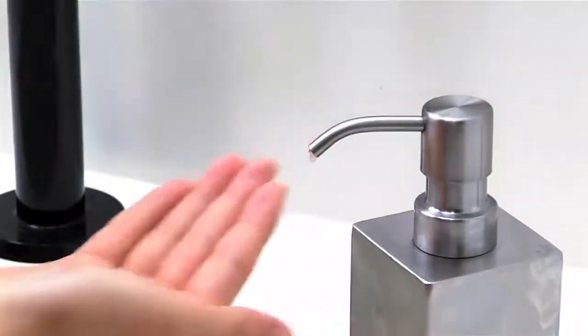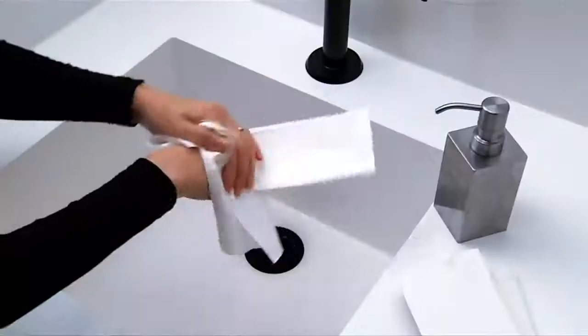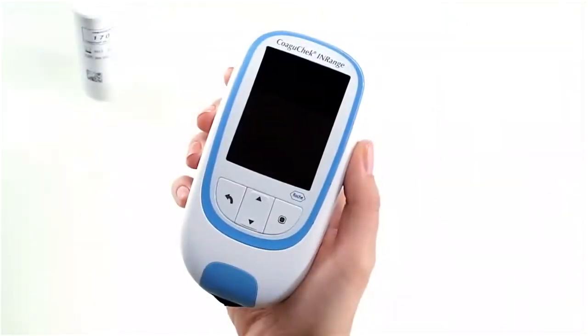To get a suitable drop of blood, always remember to wash your hands with warm water and dry them thoroughly before you test your INR value. Place the meter on a level, vibration free surface. For the purpose of this video I will hold it in my hand to demonstrate.